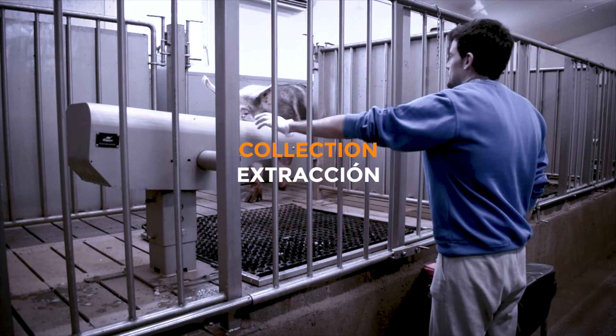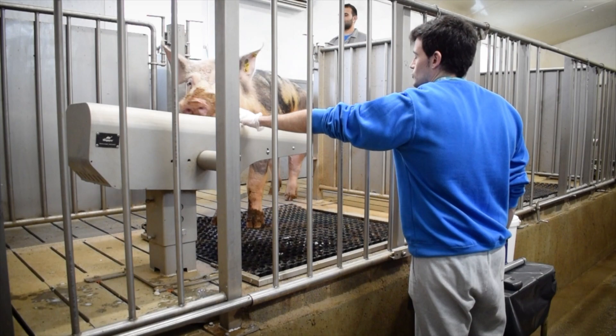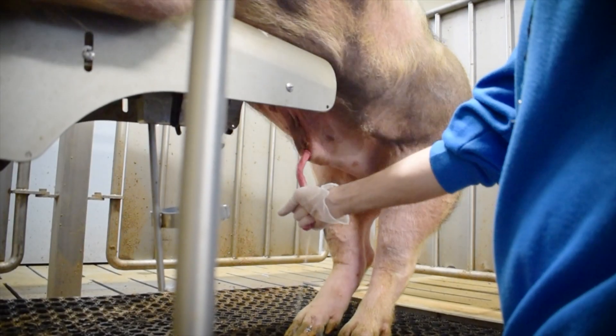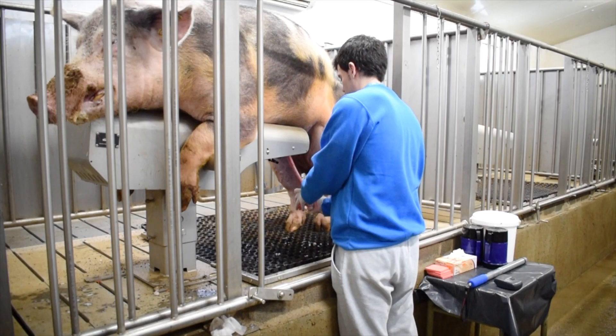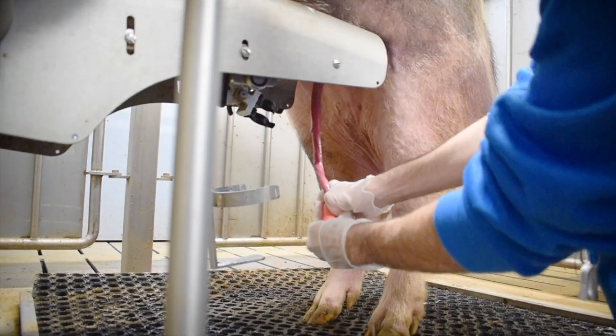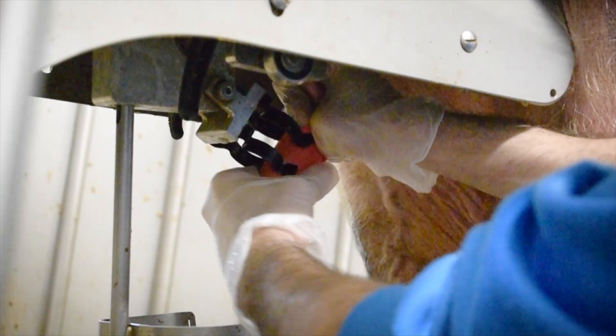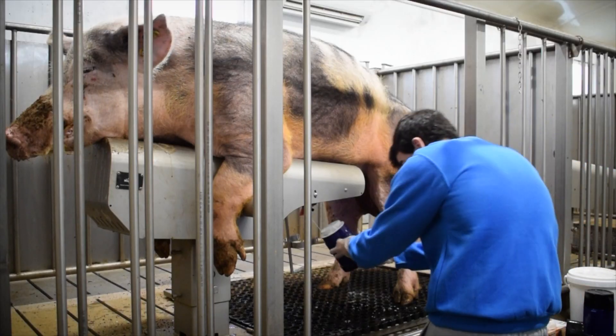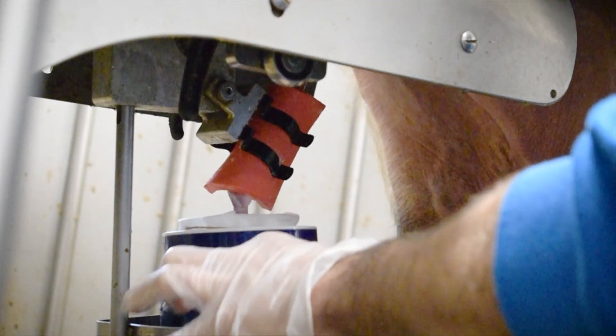For the seminal collection, Magapore has the automatic system Ergos Dummy Plus AutoCollect. Once the preputial area has been cleaned, using a disposable cervix, the penis will be held and placed in the AutoCollect system.